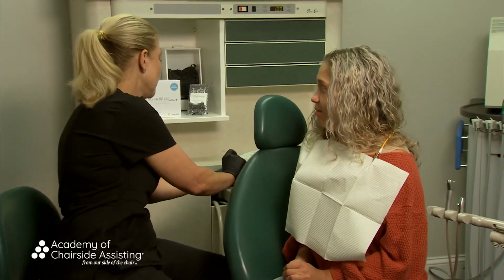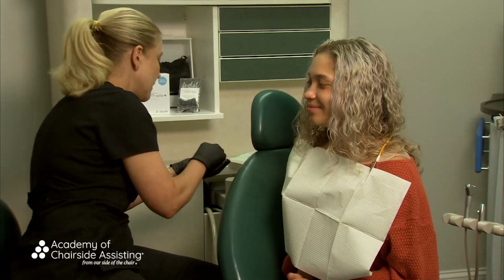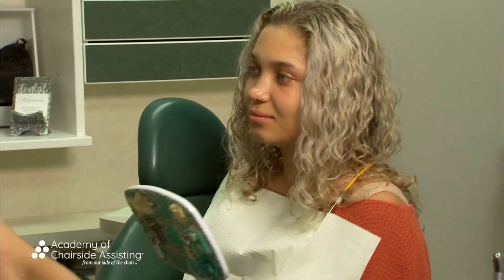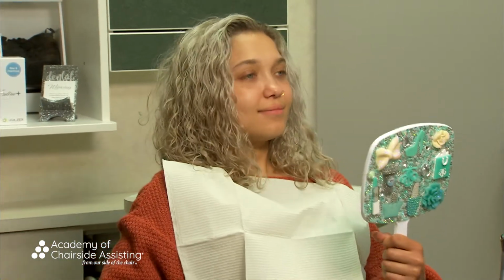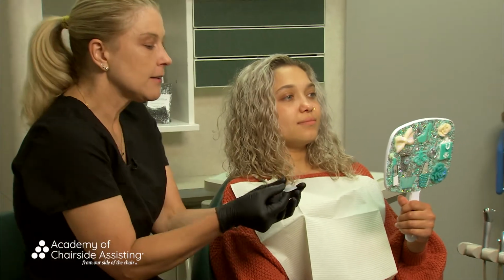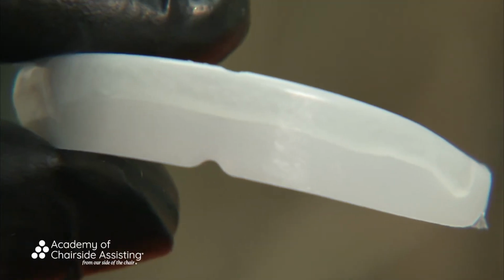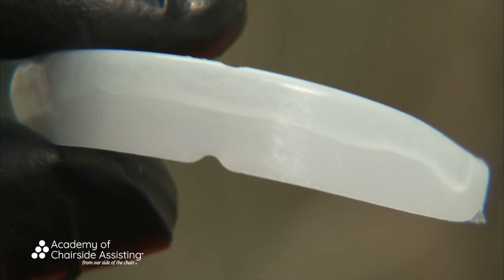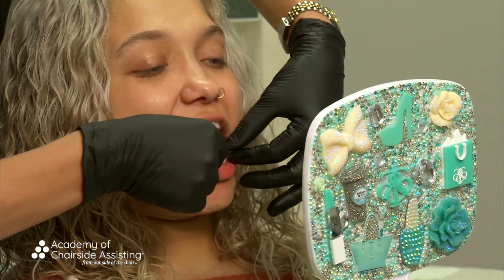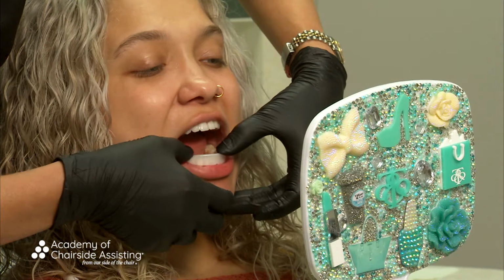And Haley, I'm going to have you just kind of watch me here, okay? And I'm going to give you a mirror. I'm going to have you hold that mirror for me, and I want you to turn your feet around this way and just watch me, okay, as I go to place this. Now, you'll see that here, there's a little mark right there in the center. Do you see that? Yes. So the first thing that I'm going to do is I'm going to see this right in the center, okay?